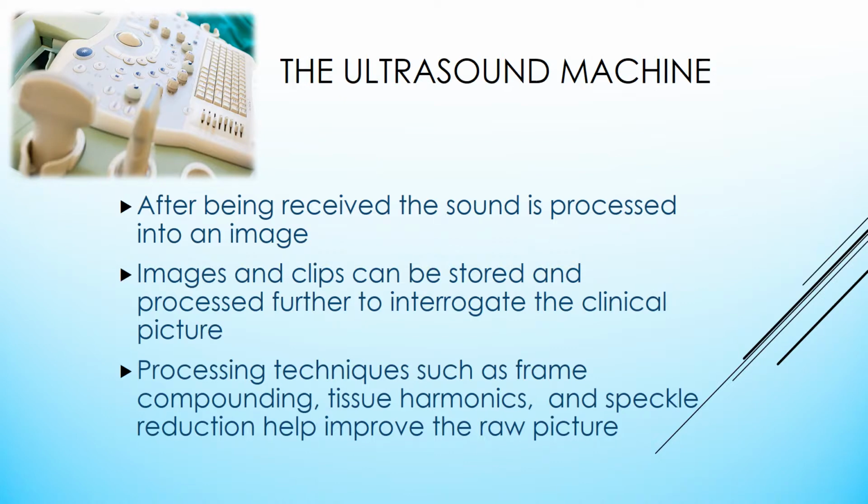After being received, the sound is processed into an image. Images and clips can be stored and processed further to interrogate the clinical picture. Processing techniques such as frame compounding, tissue harmonics, and speckle reduction help improve the raw picture.